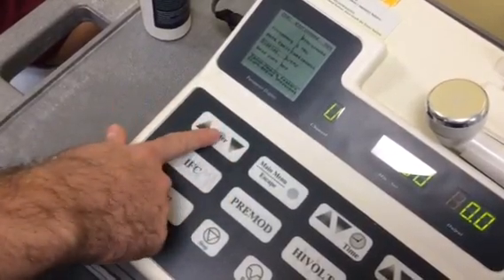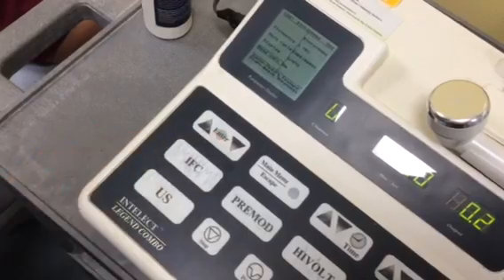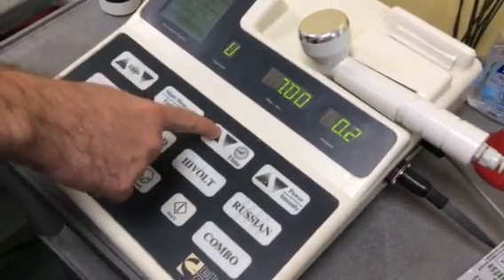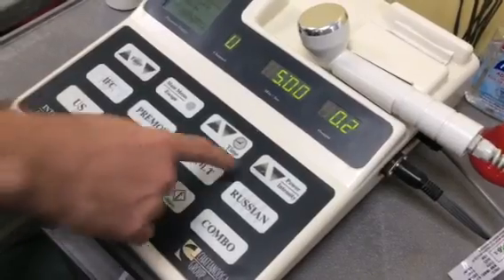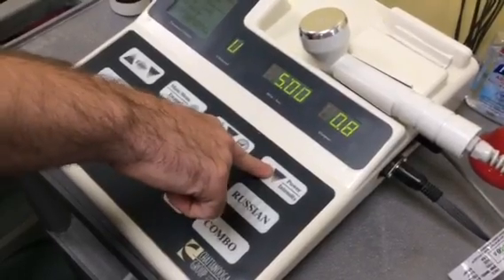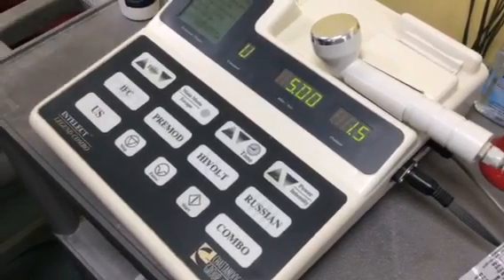We measure intensity in watts per centimeter squared, and we're always going to turn our head warmer on because it's more comfortable for the patient. Next we're going to set our time — ultrasound can usually be done between 5 to 8 minutes, and we're going to keep it at 5. For our output, that's our intensity, which ranges anywhere from 0.5 to 2.5; in this video we're going to have him do about 1.5. The next thing he's going to do is load the ultrasound head with the gel.